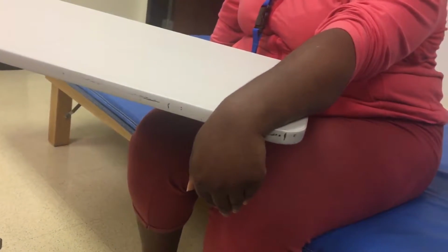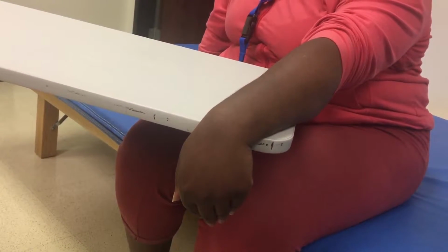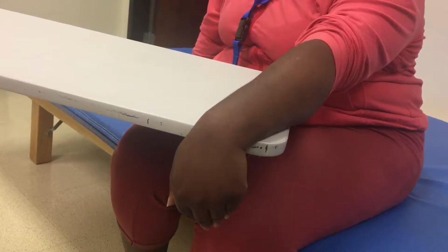So this is going to be 74. She has 0 to 74, and normal is 0 to 80. But it could be the table that is restricting her.